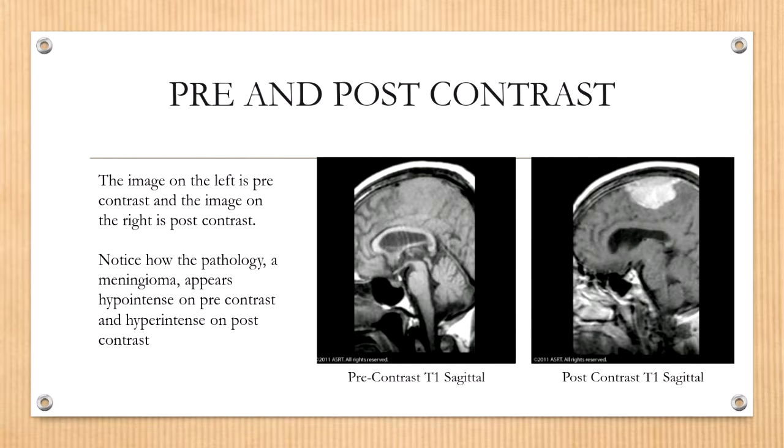On this slide, you can see two images of a sagittal brain, and one of the things you might be able to tell from these pictures is that they're using a rectangular field of view. And so we know that with rectangular field of view, we run the risk of aliasing. So when you're looking at these types of images, those are the kinds of things that you should be bringing up to yourself as you're analyzing or evaluating an image.